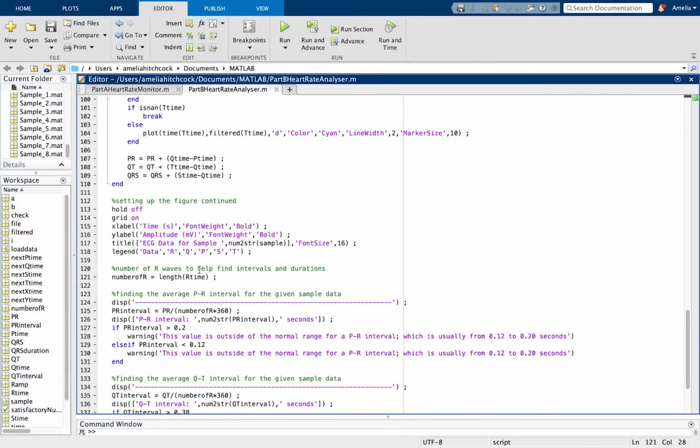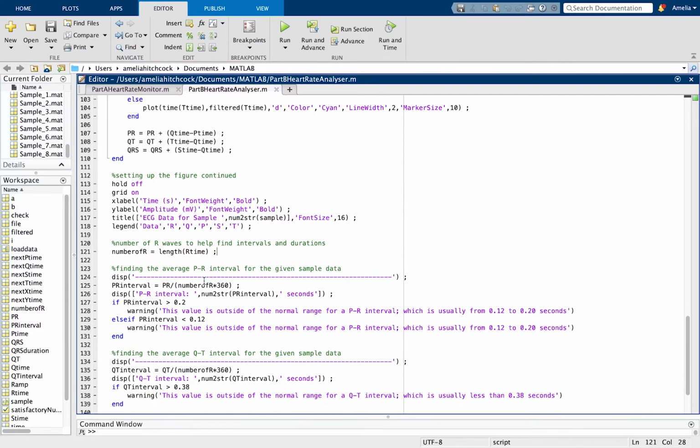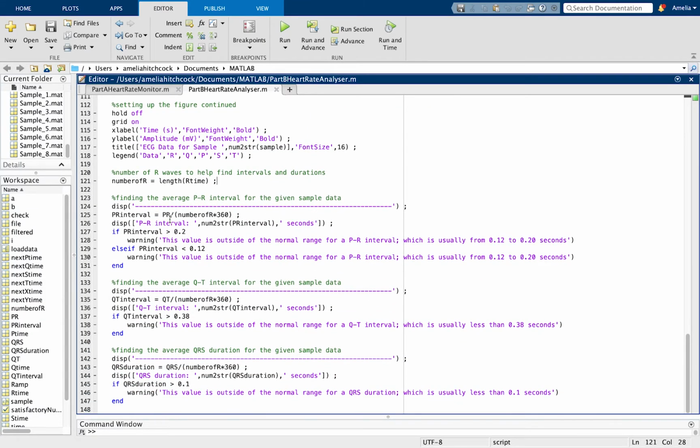This is just me finding how many times there's an R wave so it can help me with the command window. This is how I found the average, interval and durations. This is for the PR interval, the QT interval and the QRS duration. And that is my code.